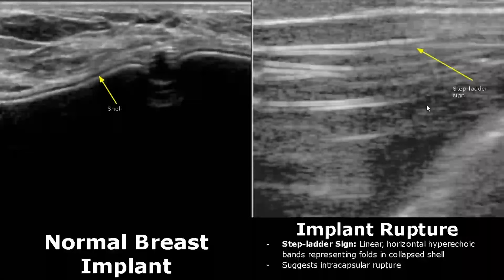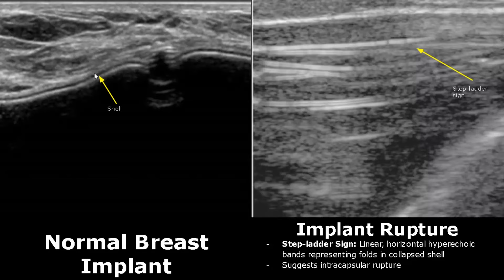A normal breast implant is anechoic with a double-layered hyperechoic shell, and these are the normal breast tissues. In an implant rupture, we have a step-ladder sign, which consists of linear horizontal hyperechoic bands representing folds of a collapsed shell, suggesting intracapsular rupture.